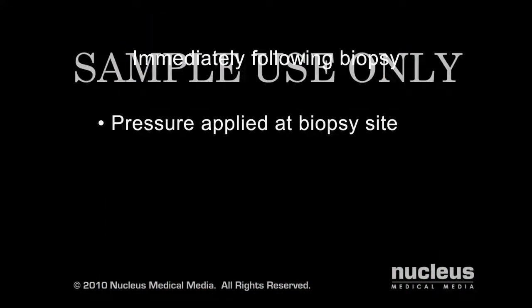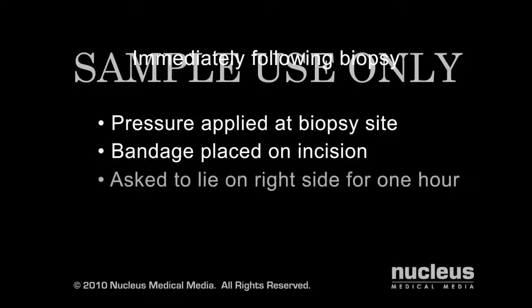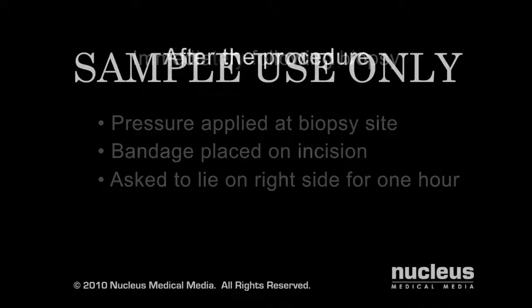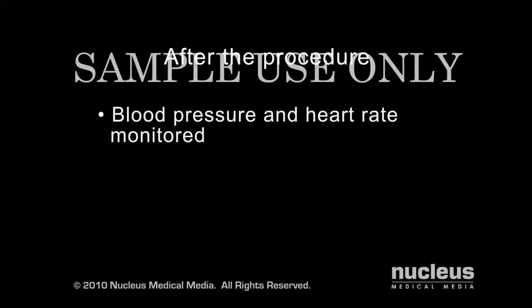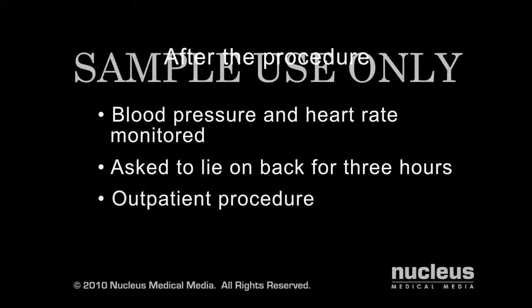Afterward, pressure will be applied at the site of the biopsy to stop any bleeding, and a bandage will be placed on the incision. You will need to lie on your right side for a minimum of 1 hour following the biopsy. After the procedure, your blood pressure and heart rate will be closely monitored. After lying on your right side for an hour or 2, you'll be asked to lie on your back for a minimum of 3 additional hours. Liver biopsies are considered outpatient procedures. If there are no complications, you will be discharged 4 to 8 hours after the procedure.